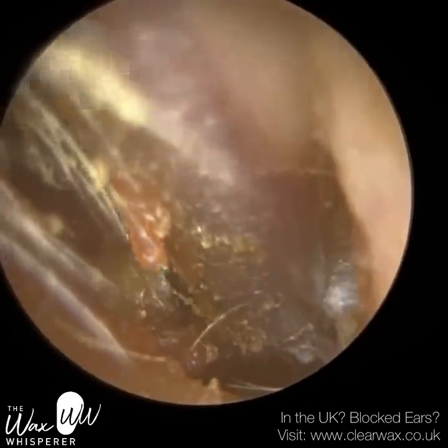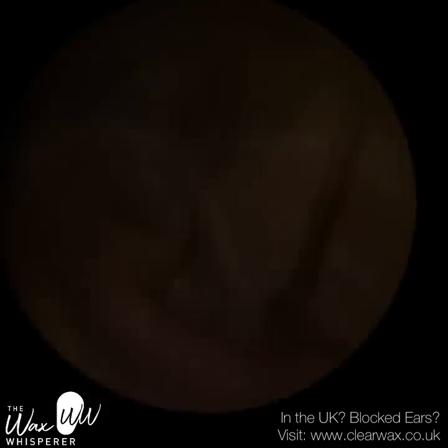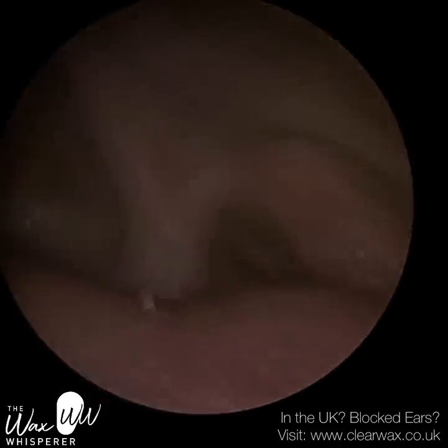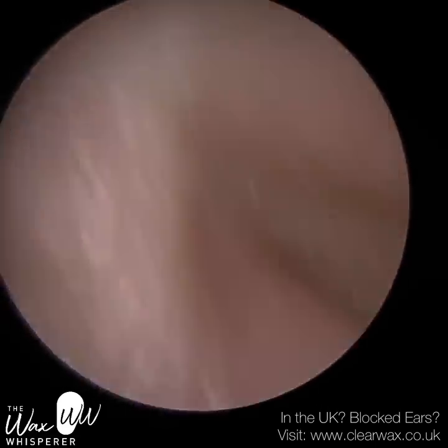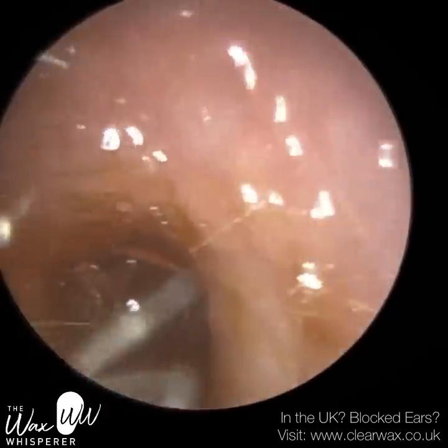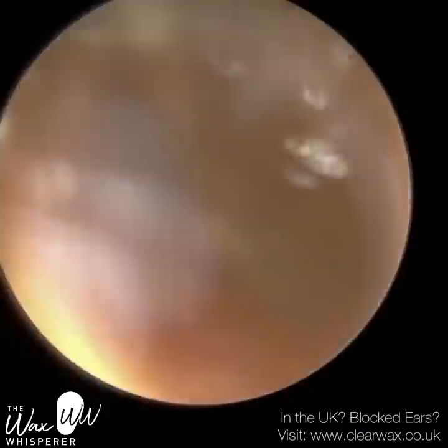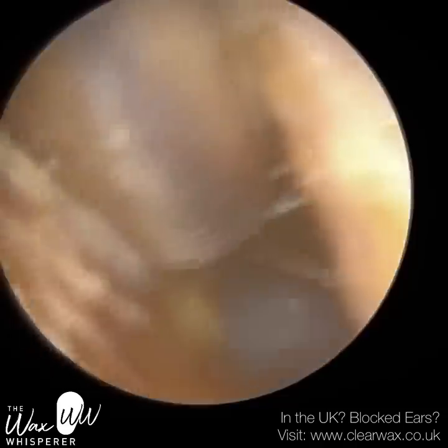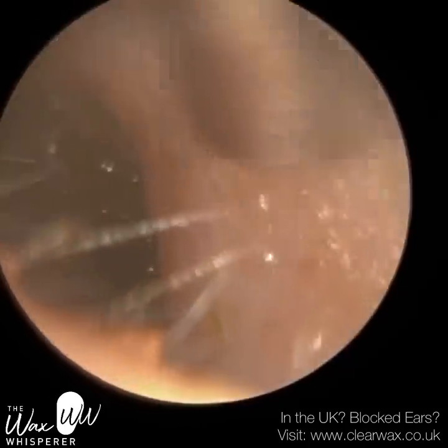I'm having a bit of difficulty suctioning this wax because of the consistency. It's quite sticky and glutinous, so I've just put some medical-grade olive oil spray in. But because of that narrowing, it didn't go all the way through the ear canal — that wax is still left untouched. So I applied some more olive oil spray, inserting the nozzle a bit deeper to get beyond the narrowing. Now that oil has started to penetrate the deeper wax.